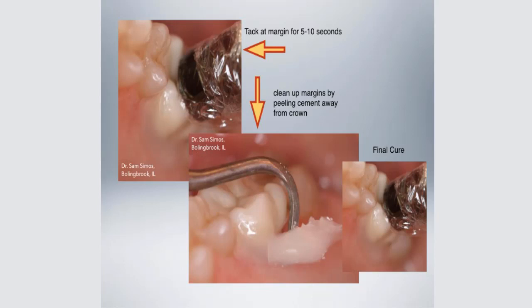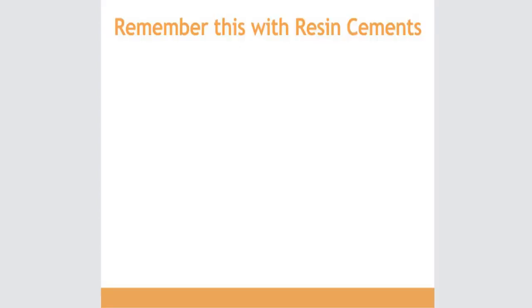Very, very easy. And then interproximally, when you've cleaned the buccal and the lingual, interproximally just put a little explorer through the interproximal and remove anything in the interproximal, and I'll final cure. And I'll do a 20-second cure on the buccal, 20-second cure on the lingual. Very, very easy, very, very predictable, and you don't have to worry about anything. This is a very strong cure.